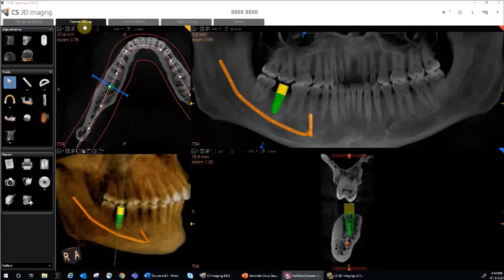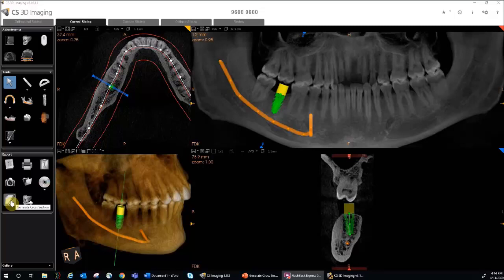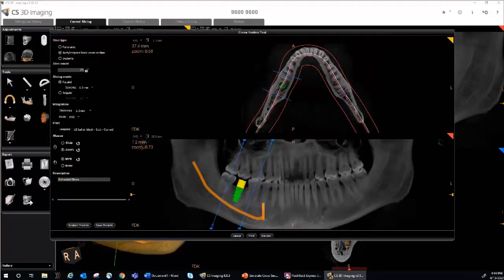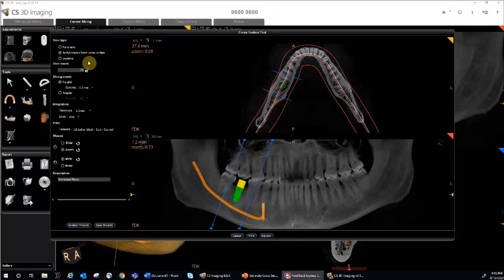To create a cross-section, select the appropriate slicing tab at the top. Then, under the Export Tools area, click the Generate Cross-Section button. The cross-section tool dialog window will appear. First, select the slice type. The region of interest views change depending on the selected slice type.